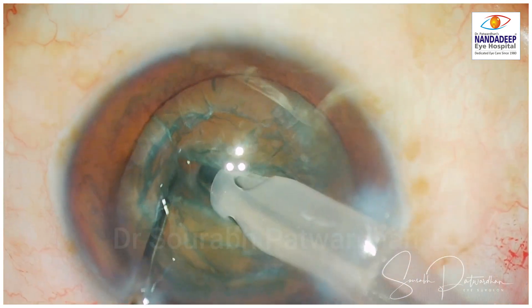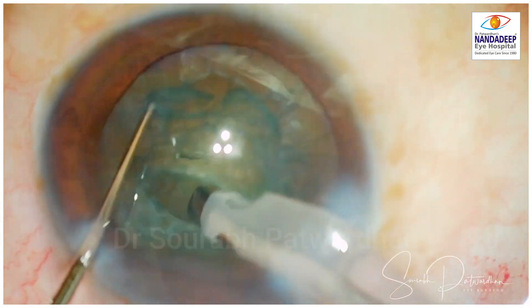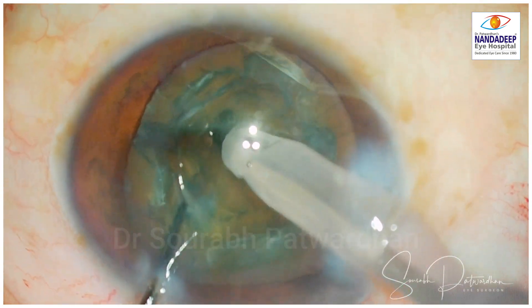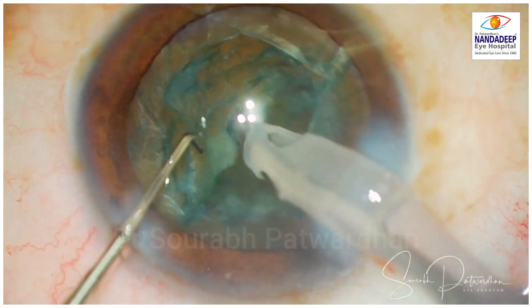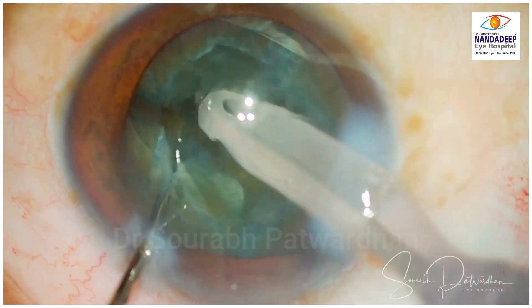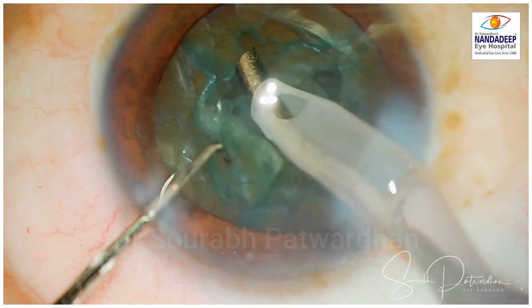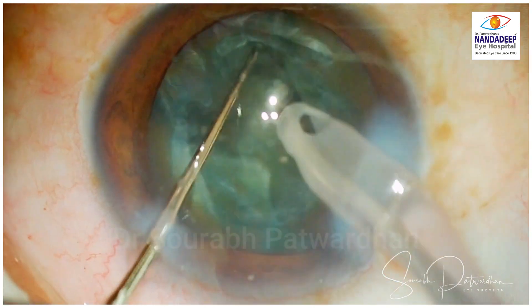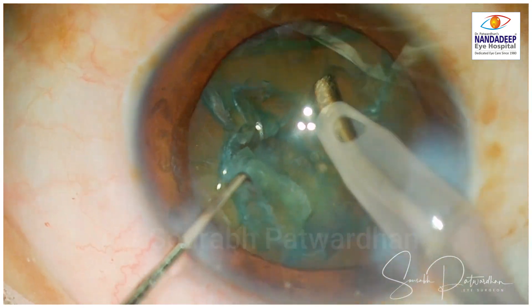You can either do hydro prolapse or you can do trench divide. But as you can see here, when you do trench divide, there is a lot of cheese wiring which may happen. So you have to make a deep trench and try to split the nucleus. Many times this split is incomplete because of the cortical sticky fibers which hold on to these pieces of nucleus. You have to make sure that you get a split somewhere, because otherwise, as you can see here, I am trying to take out this one quadrant and the cortical sticky fibers are not allowing it to come out. That's when you keep chipping on the nucleus and ultimately it leads to a bowl.